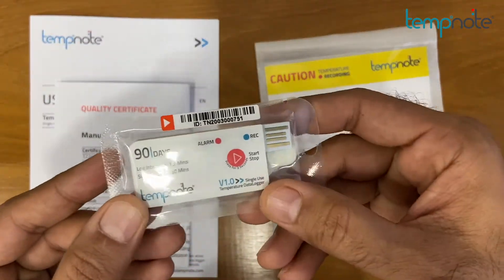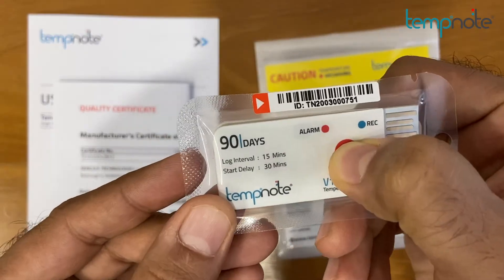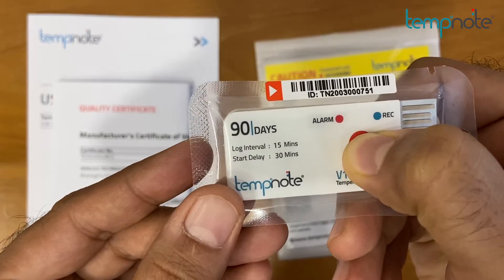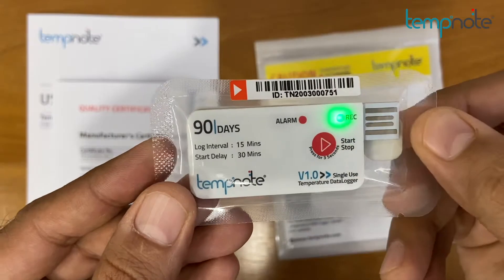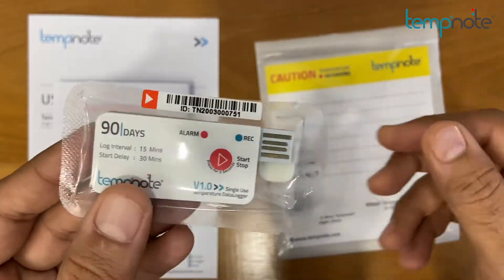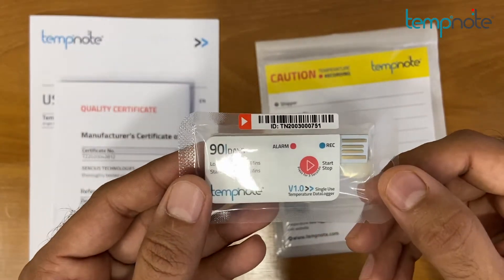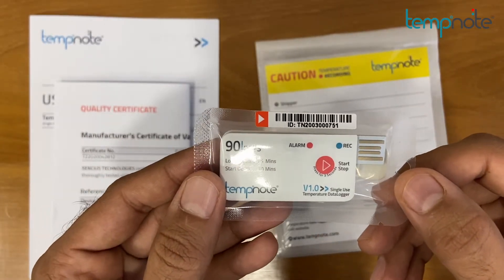TempNote V1 has only one button for start and stop function. To start TempNote V1, the button needs to be long pressed for at least 3 seconds. The green light will illuminate for a long time, indicating successful start of the device. The green light will also blink every 10 seconds, which indicates recording is in progress.